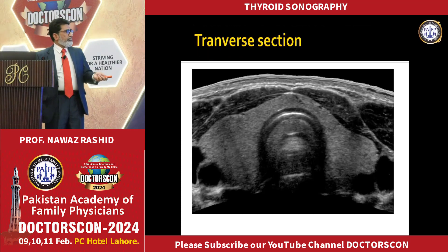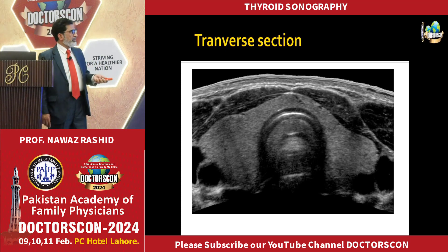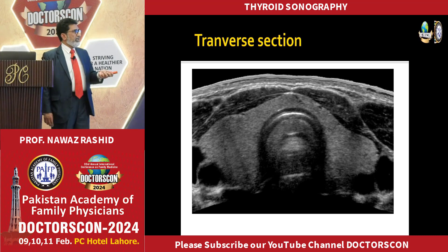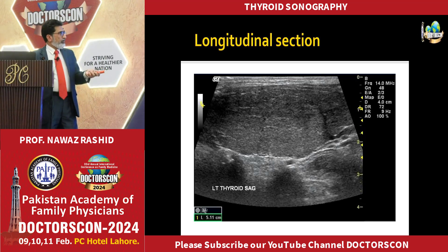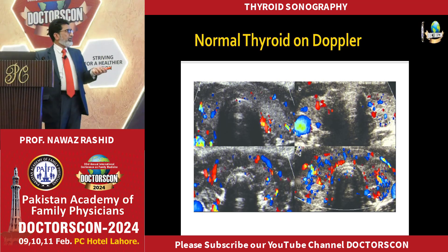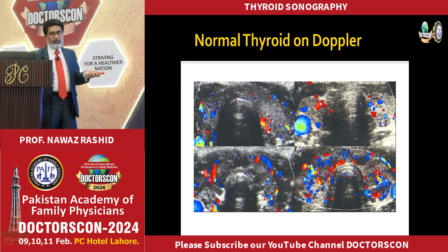This is the longitudinal section — this is the right lobe of the thyroid, this is the left lobe, and it is hyperechoic to the surrounding muscles. The normal thyroid on Doppler shows quite adequate blood flow.